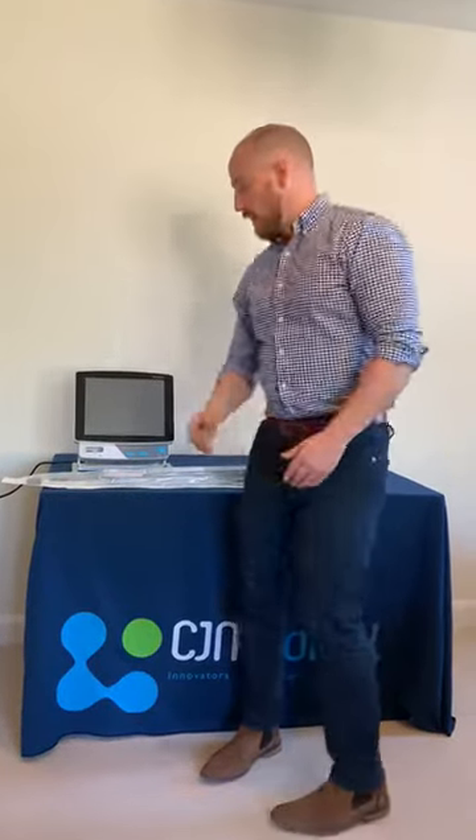Hi there. I'm just going to introduce how to set up the new CJ Medical single patient use bronchoscope. As you can see, the device comes in its own sterile pack.